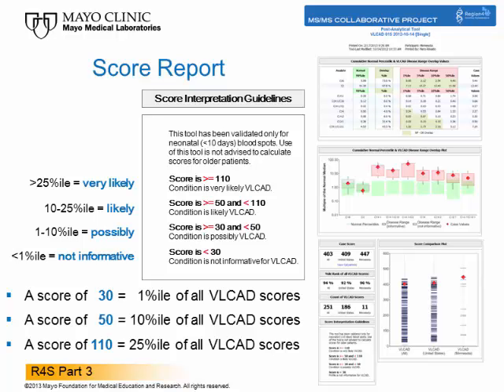Although these thresholds are used consistently in all the tools available to users from every site, the so-called general tools, the selection of interpretation guidelines and of any additional text shown at the top of this section is entirely up to the user who either creates or modifies a tool using the tool builder.